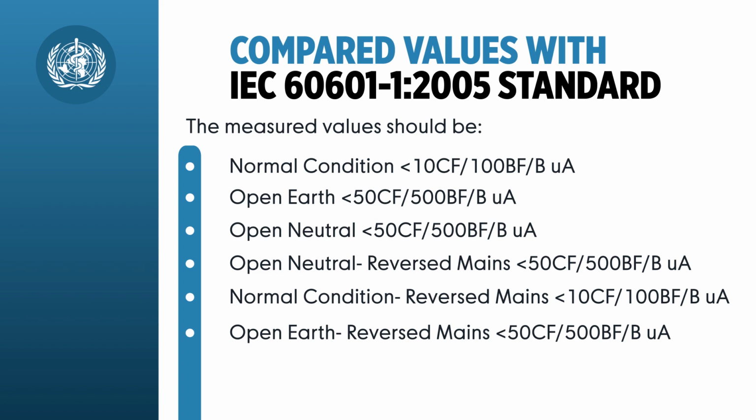Normal condition, reversed mains, less than 10 CF, less than 100 BF or B microamps. Open earth, reversed mains, less than 50 CF, less than 500 BF or B microamps.